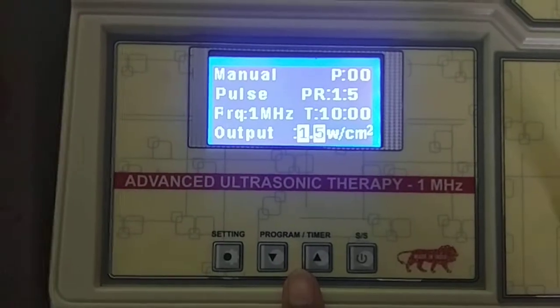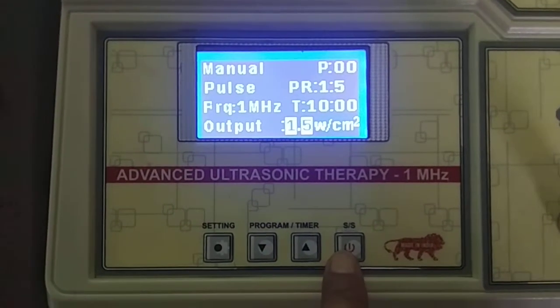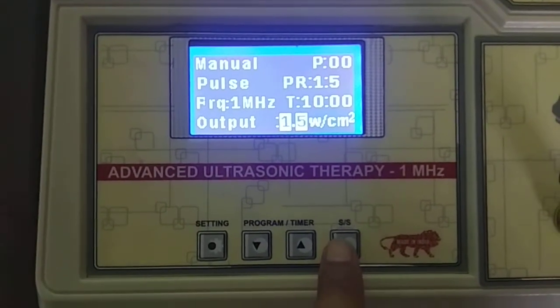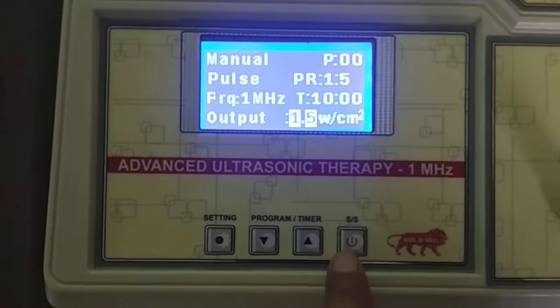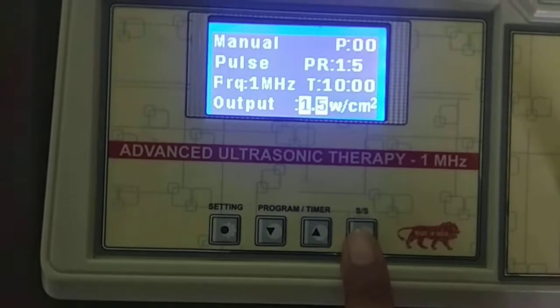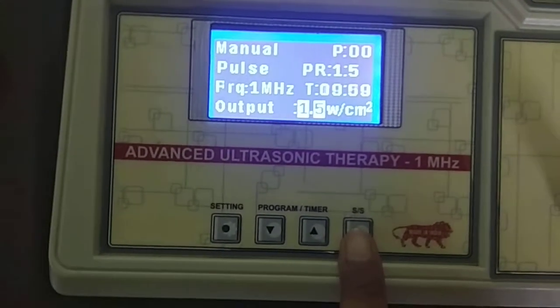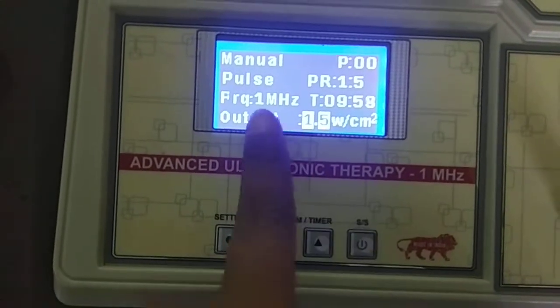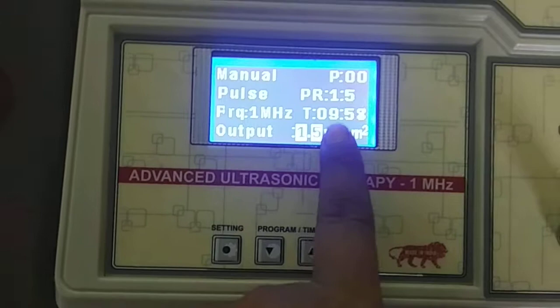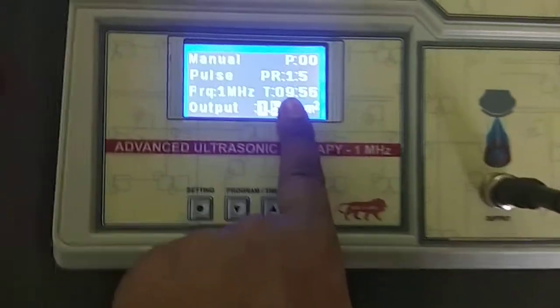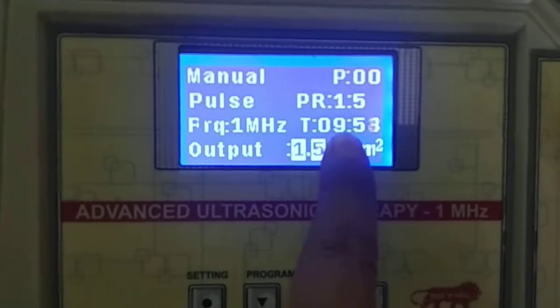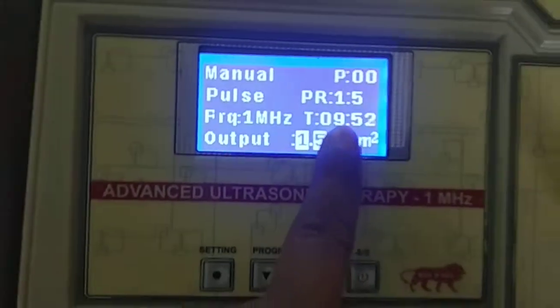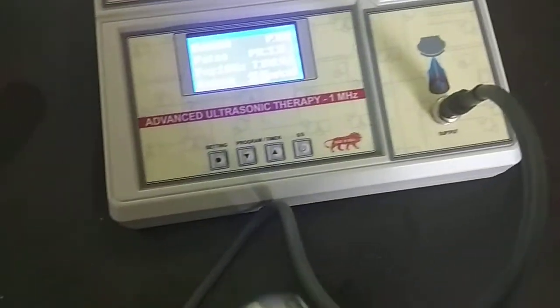Finally, I start the device program by pressing this key. Now the program is in Running mode. You can see the countdown time and you can apply the same way.